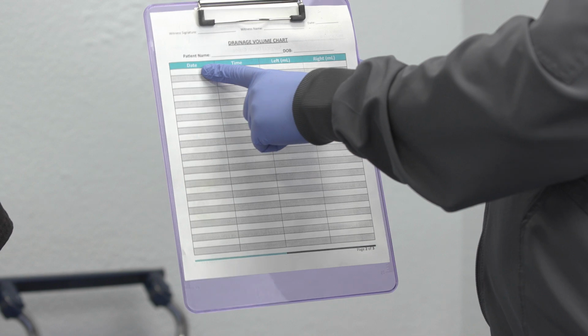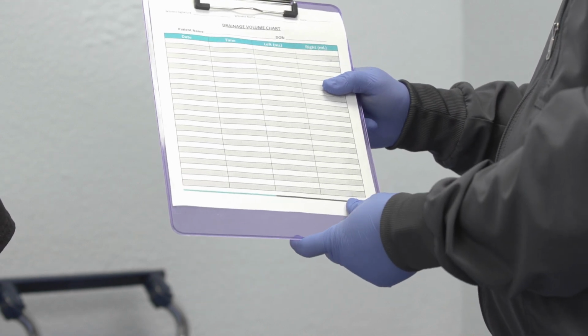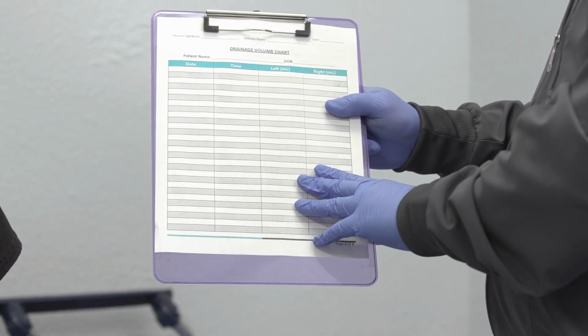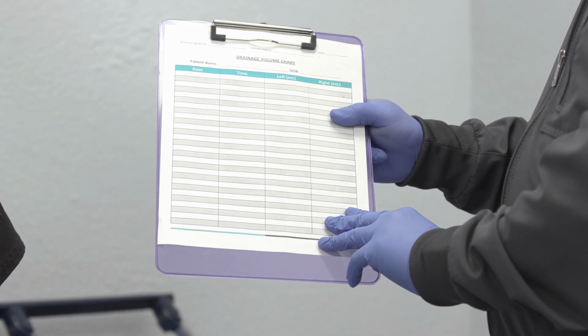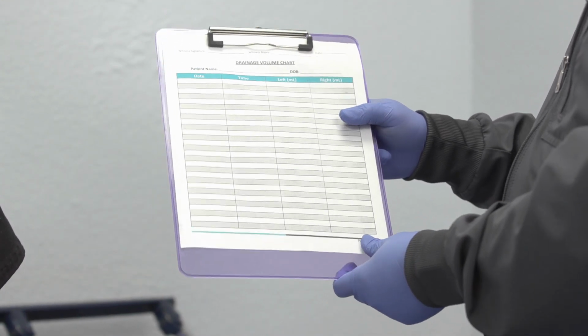And you need to do this every day until the drains are removed. You need to make sure that this form is kept up with and kept somewhere safe so it can go with you to all your appointments, so your surgeon knows how much drainage is coming out of your drains.